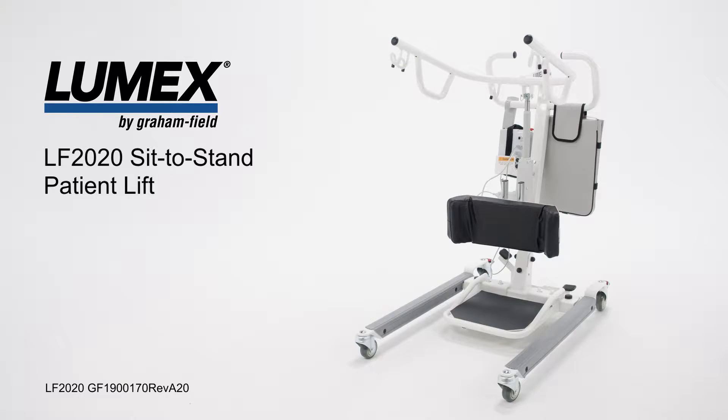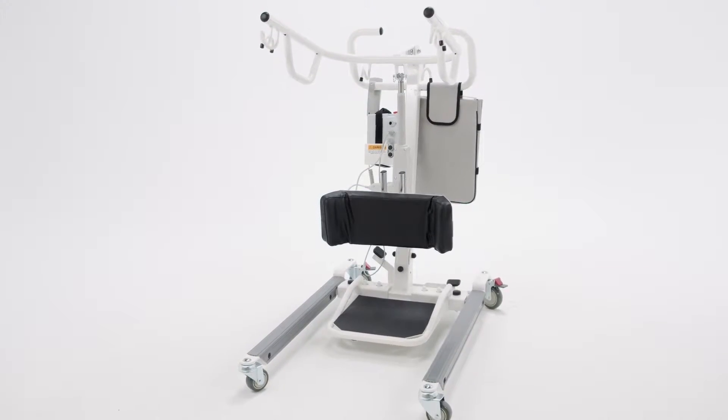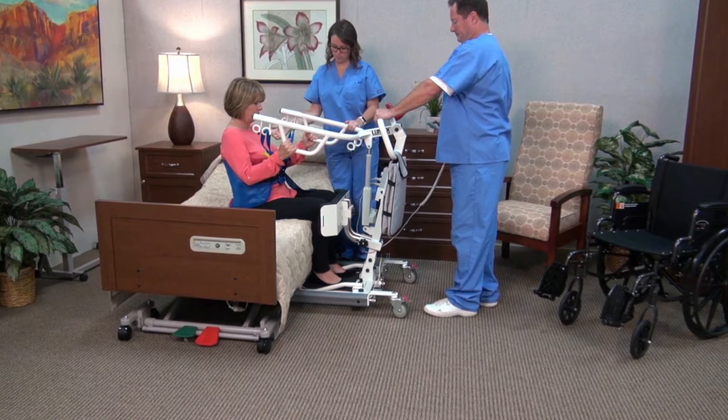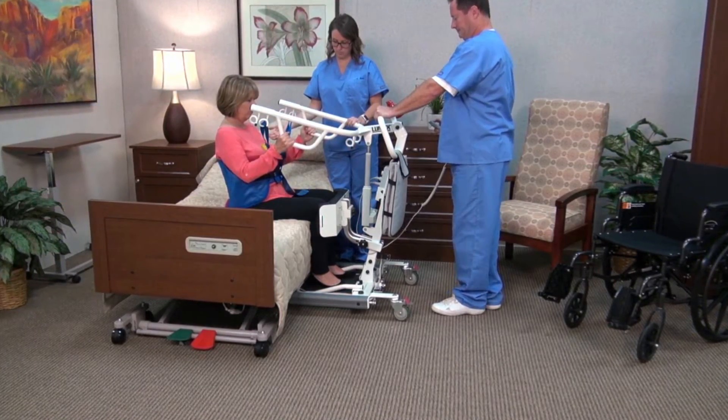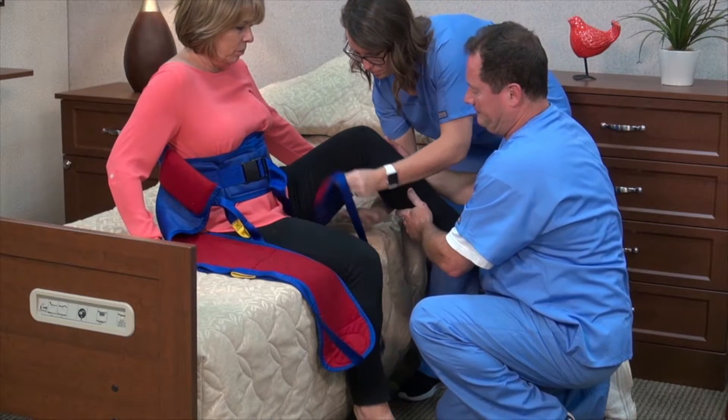Hello, I would like to introduce you to the Lumex LF-2020 Sit-to-Stand Patient Lift. The Lumex LF-2020 Sit-to-Stand Patient Lift is a battery-powered lift used for patients with adequate arm and leg strength to support themselves while having difficulty standing up on their own from a seated position.